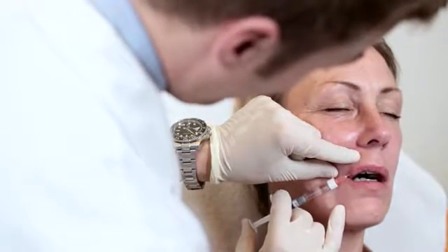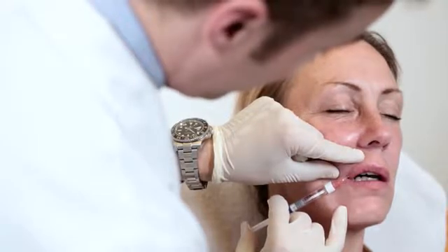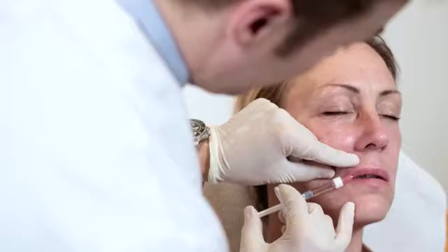In patients with thick dermis, the Restylane Restore products offer great lifting capacity and with that great value per syringe. I go along the red of the lip and inject small quantities as I retract. The goal here is simply to even out the difference in fullness rather than changing the look of her lips. A low extrusion force guarantees an even distribution of the product. Smile, open mouth. Looks good to me. Let's go on with the next treatment area.